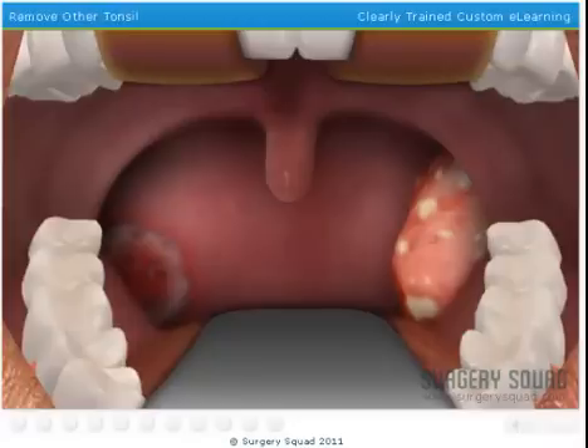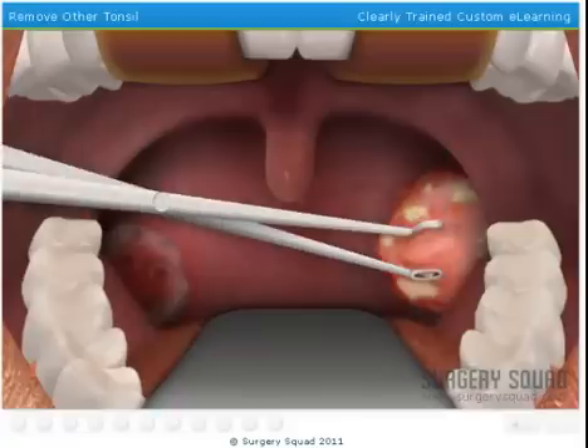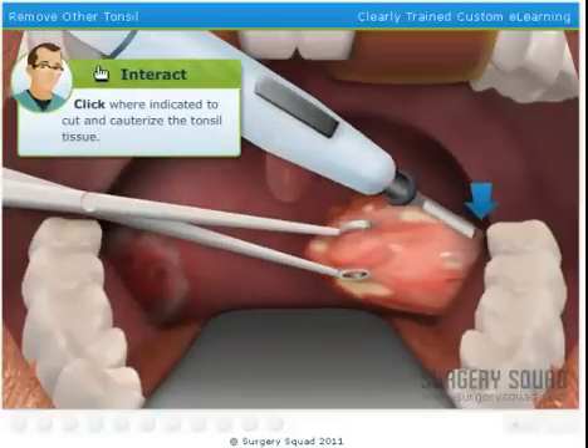Now we repeat our steps on the other side of the throat. Extend the other tonsil with the tonsil forceps. Just like the other side, we'll cauterize this tonsil to release it while keeping blood loss to a minimum.